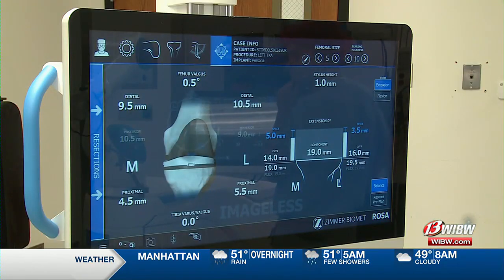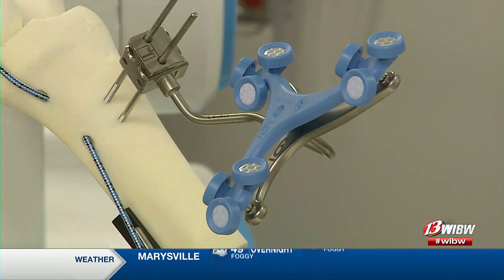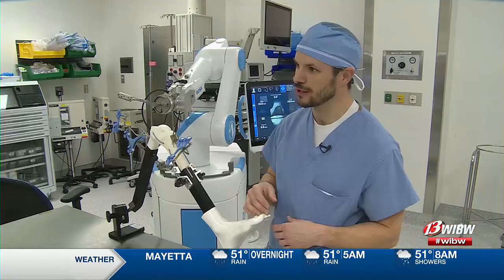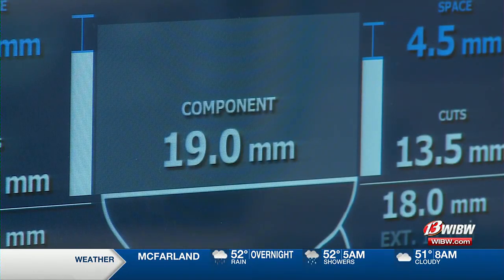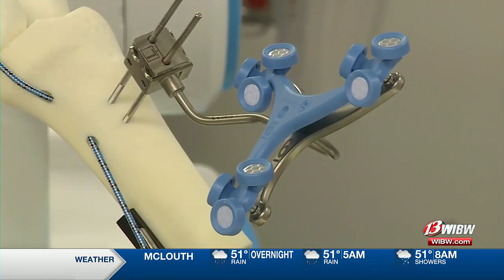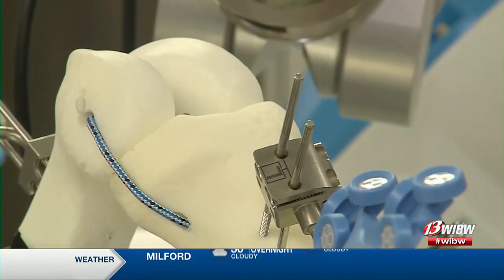An even newer development uses a computer to map out the knee, taking into account how everything moves. There's a high-speed infrared camera that knows where both the robot as well as the patient's bone is in space. We're shooting to create equal gaps — that gap measurement is essentially how much tension is on the soft tissue. So rather than having to release soft tissue structure and cut structures that you potentially need, I'm leaving the soft tissue intact and instead recreating a more anatomic cut of the bone.